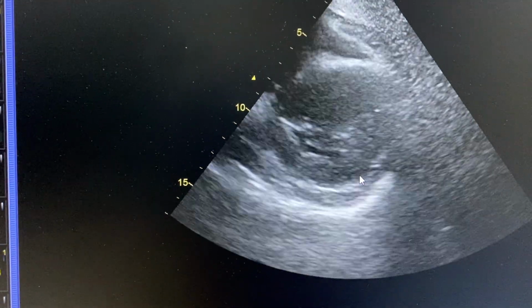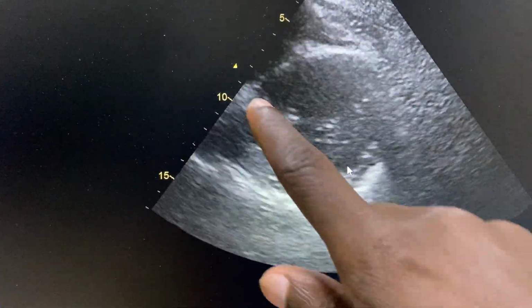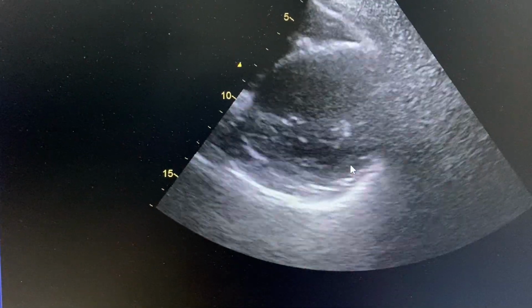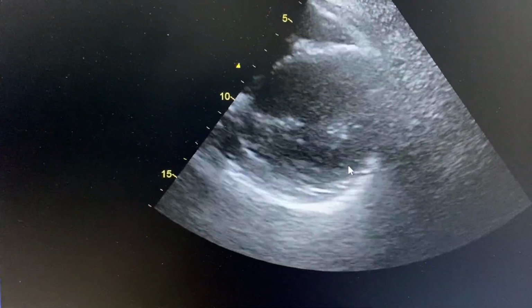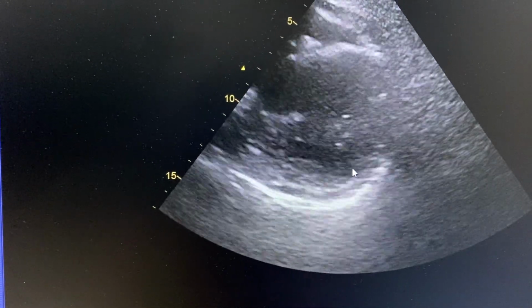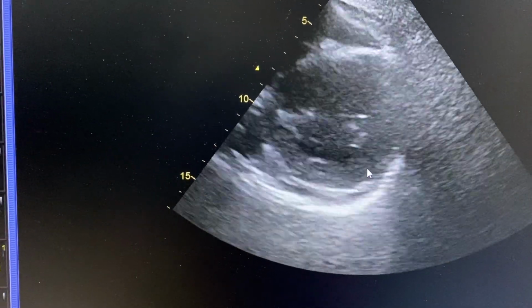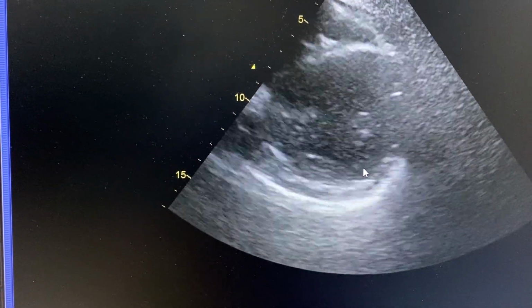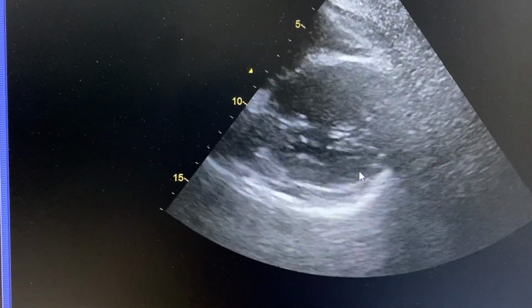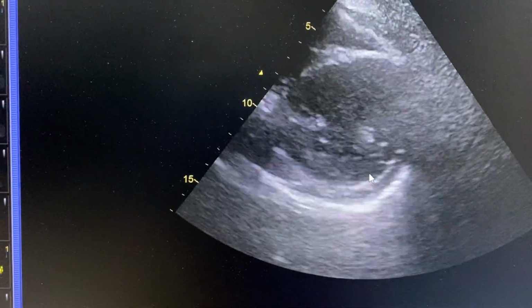But again, remember the tethering effect. The tethering effect is affecting the anterior septum and then the anterolateral. They are being tethered, pulled by the neighboring moving myocardium, or they prevent the neighboring normal myocardium from moving, because for them they are not moving. But in general, the anterior wall is not moving. From the base now to the mid, let's see what is happening to the apex.